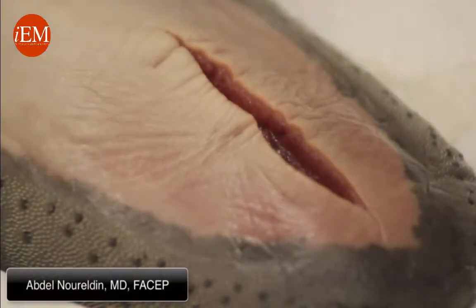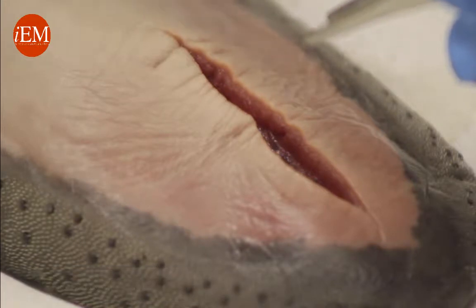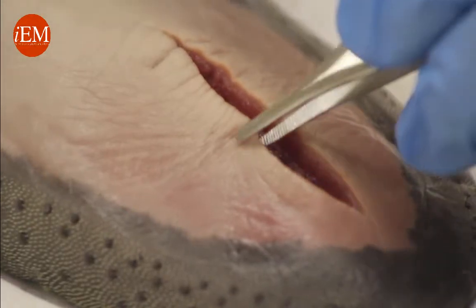Now we're going to show you how to do a simple interrupted stitch. Number one is your driver — your needle holder — and your forceps. Your needle holder and your forceps should be like a knife and a fork when you're eating; you should always use them together.